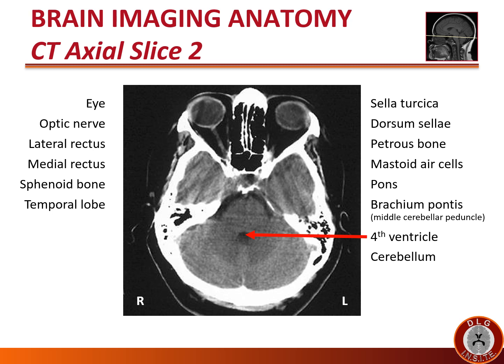The fourth ventricle lies posterior to the pons and anterior to the vermis of the cerebellum. It is black because it consists of cerebrospinal fluid. The cerebellum lies behind the pons in the posterior fossa. Note that the cerebellar parenchyma goes across the midline. The central part of the cerebellum is called the vermis, and there is no fissure or CSF structure between the two sides.